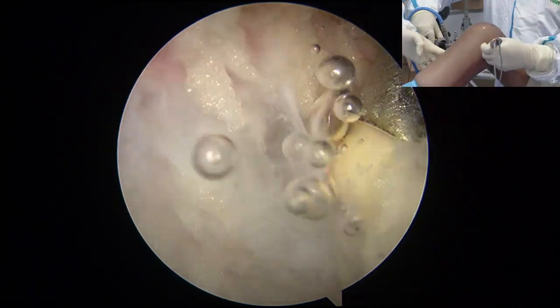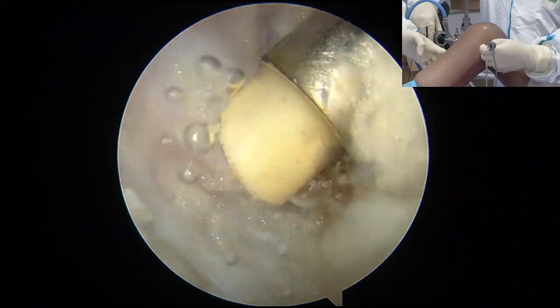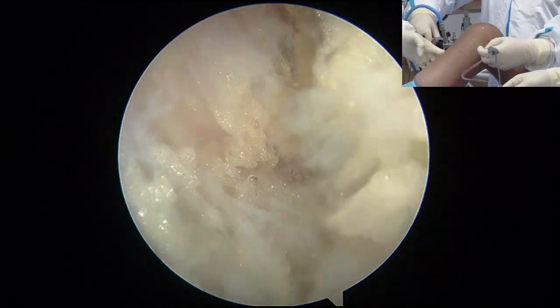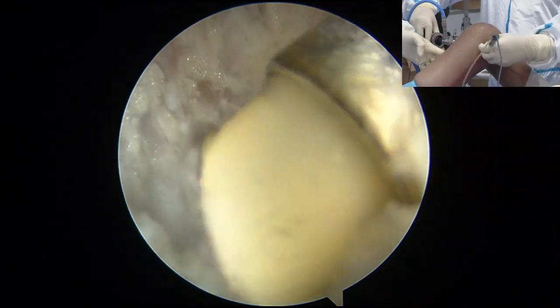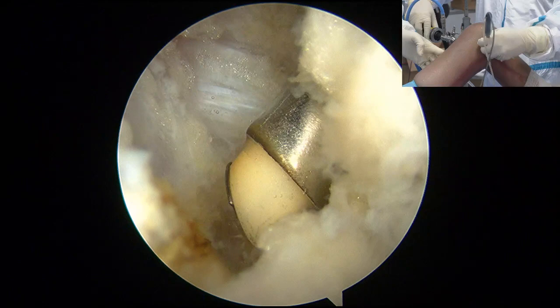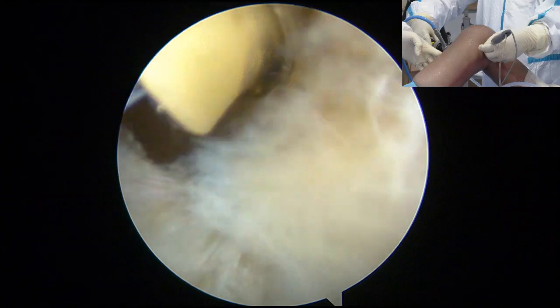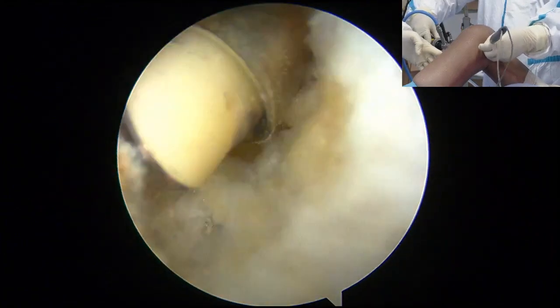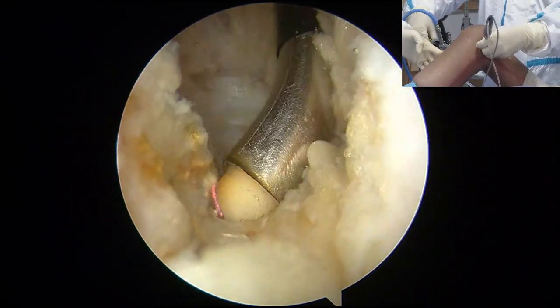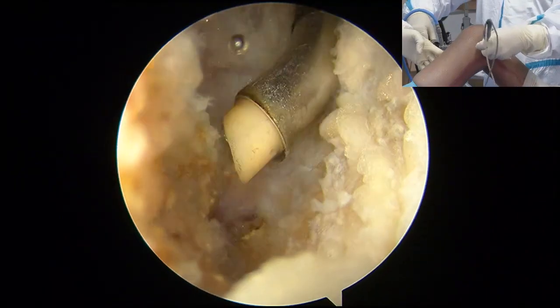Okay, it's also clean. For the PVNS, you need to clean like this. The pigmented villonodular synovitis, because it's really aggressive. You need really good exposures. Same like I do today, okay? For PCL, you can clean to the center. That's enough. Okay. Like that. That's for PCL. 那如果是做 PCL 手术的话呢，考虑到滑膜炎比较重，所以需要用射频刀去做这个组织的松解，要松解到中线为止。Okay, like that way.